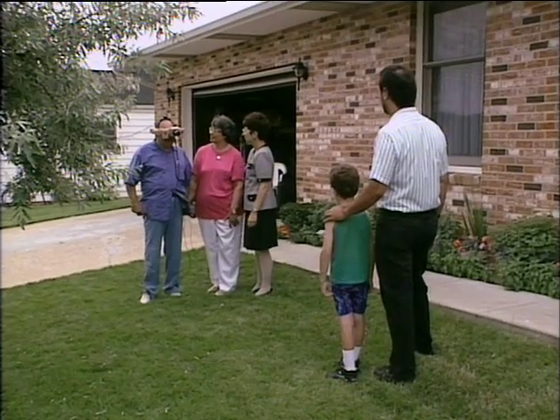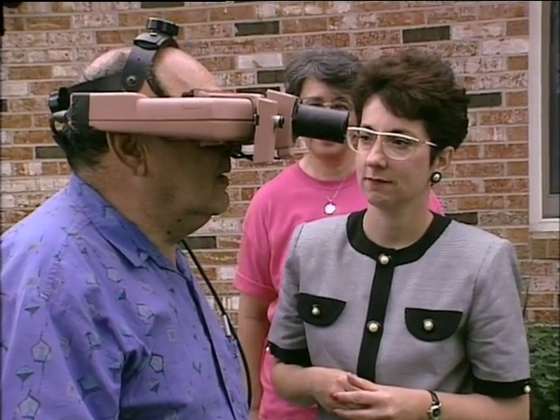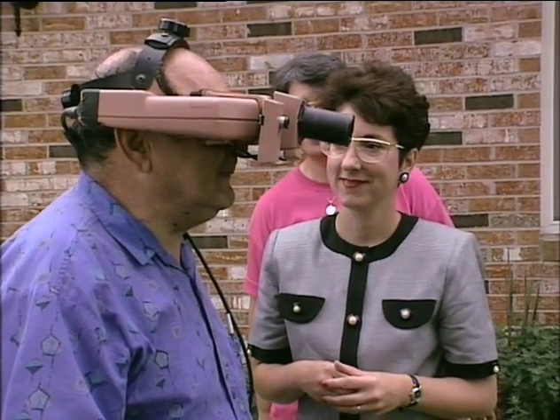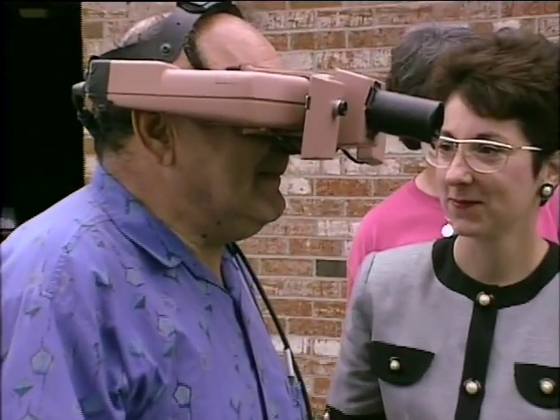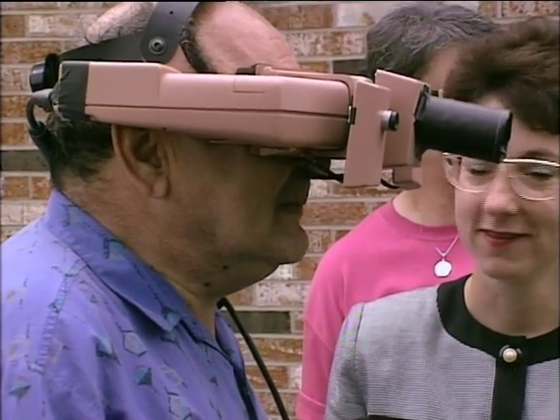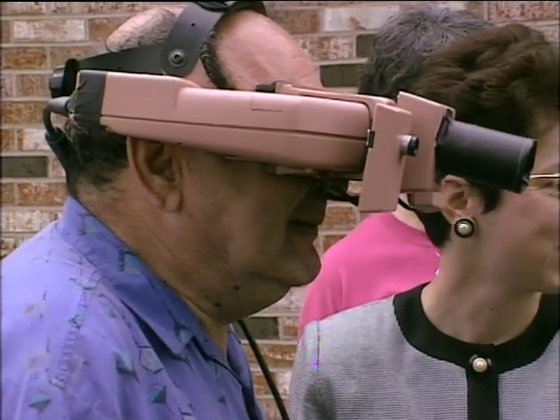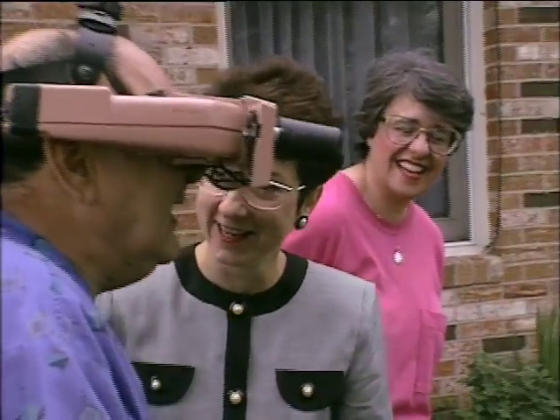Now, this is a very interesting test because at present, the helmet gives a view only marginally better than Leonard's conventional aids. Doesn't this thing look crazy, Joel? Crazy or not, it does seem to work. It's easier to use. He doesn't have to think about it or line it up. He can get on with what really matters. Getting a good picture. Real good. What does he look like? Beautiful.